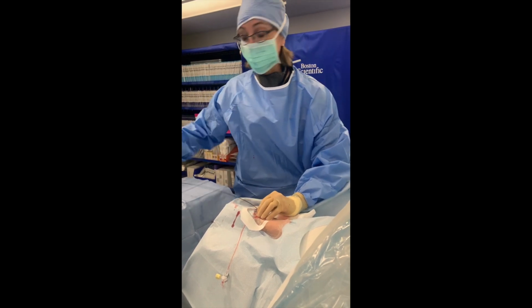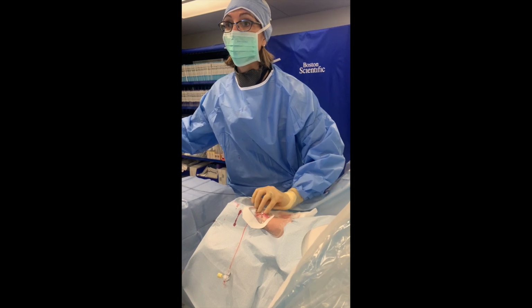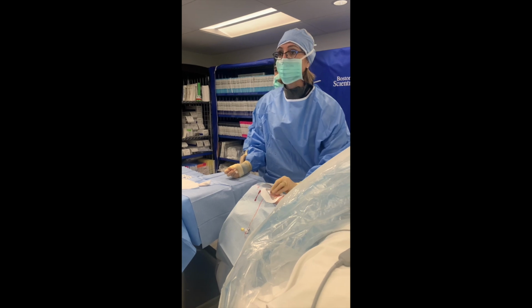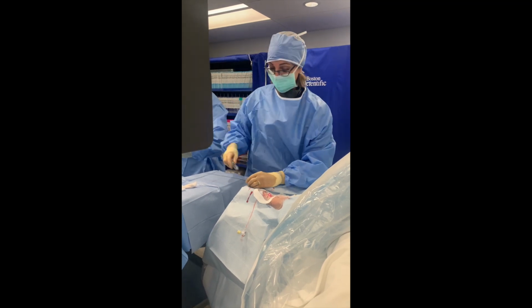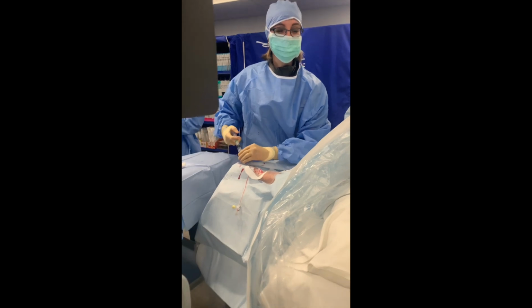So we're already down in the abdomen, Jill, as you can see. Yep. And Isaac's going to move the II. Always important to watch the tip of this wire. Today is a good day because we're going on the right, and my template dictation starts with it on its right, but everybody else goes to the left. It means I have to change my template. Thank you.